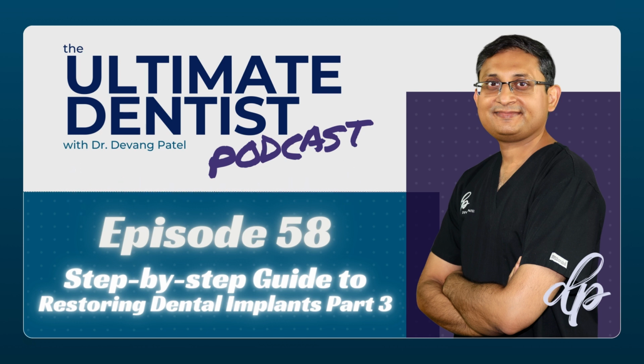Now generally we use temp bond or a temporary cement material. You don't use a permanent cement material like Panavia or anything like that, and we will discuss why in the last episode, number 6 of this series. So make sure that you use a custom abutment. That's what I wanted to say. Now let's come to the screw retained implant crown, which is certainly my choice of restoration.